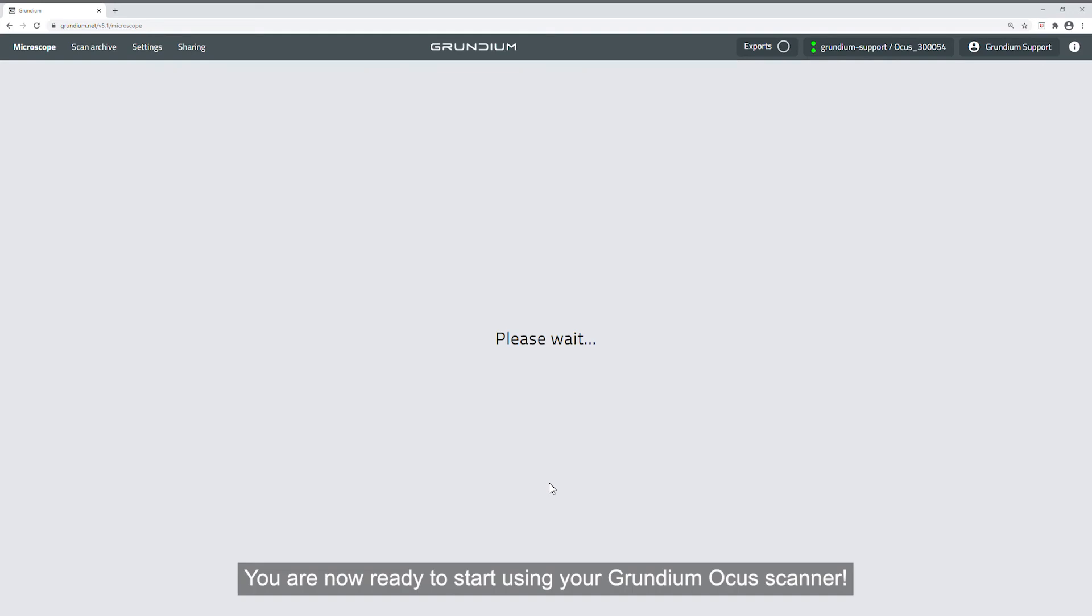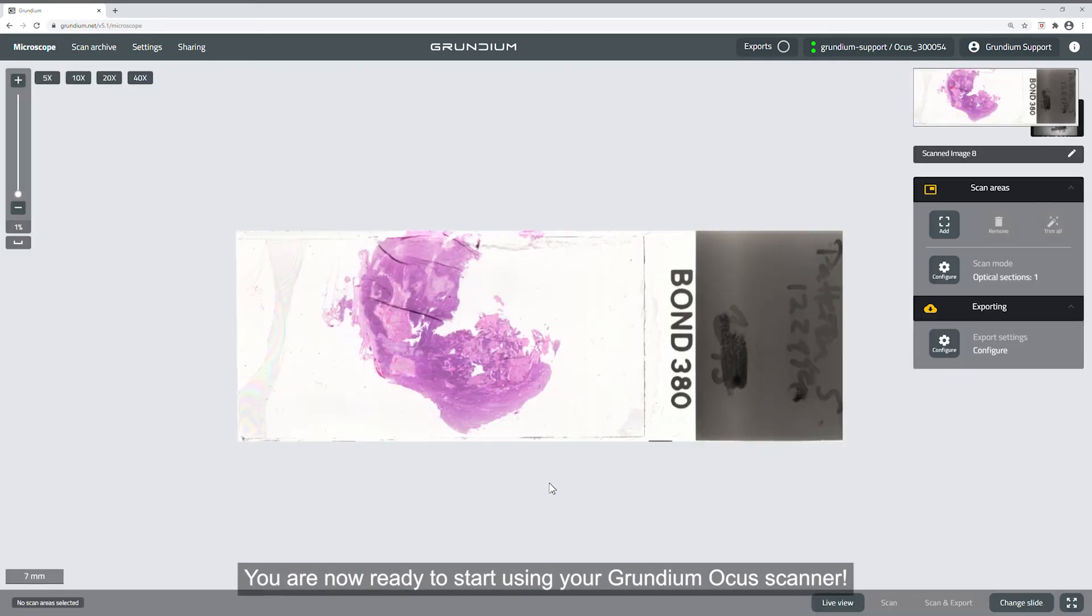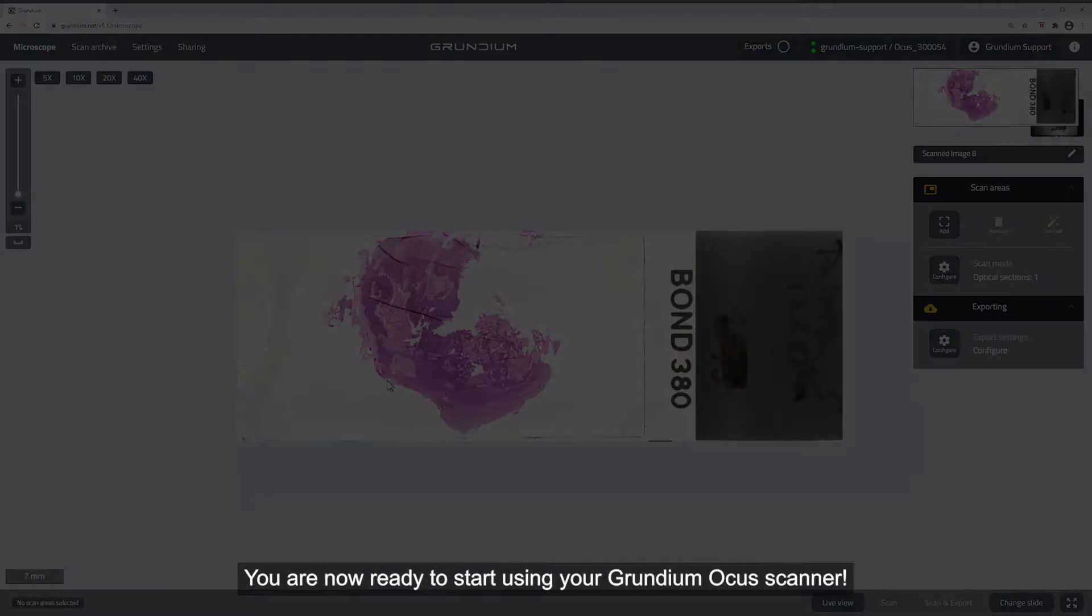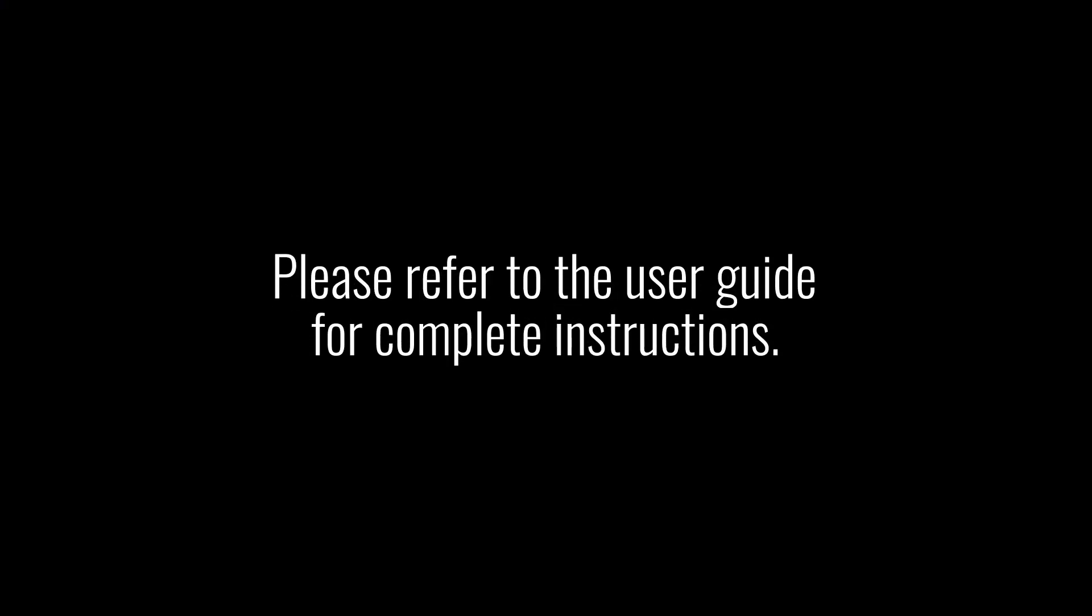You are now ready to start using your Grundium Ocus scanner. Please refer to the user guide for complete instructions.